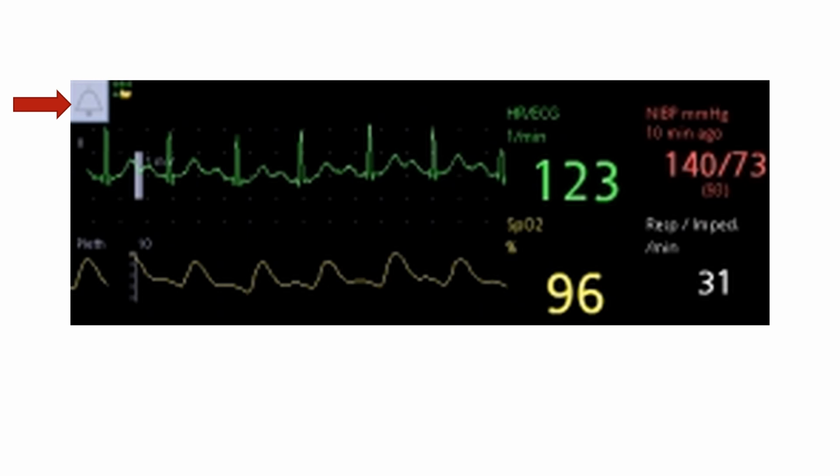Several of the alarms are triggered by poor signals on the ECG channel. This can be avoided by checking the 12-lead ECG and choosing monitor leads with best QRS voltages. Poor electrode contact is another reason, which can be avoided by cleaning the contacts and changing the disposable patches once a day or if damaged.